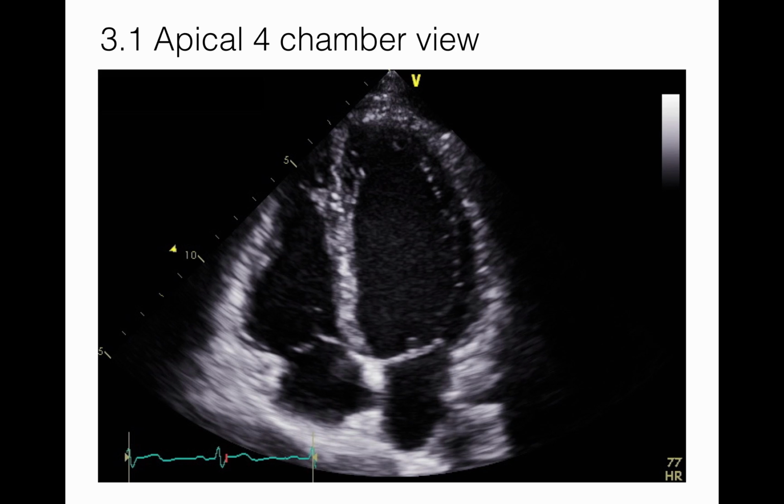The ventricular and atrial chambers should be free of echoes, that is, black. Normally, the left ventricle is the largest chamber with the greatest muscle mass, and the left ventricle forms the majority of the apex of the heart. The atria will be similar in size, with the left atrium modestly larger than the right, and the interatrial septum should also be seen.